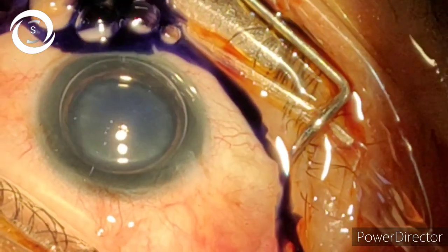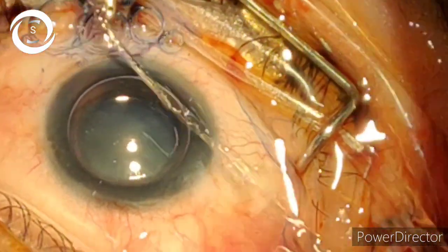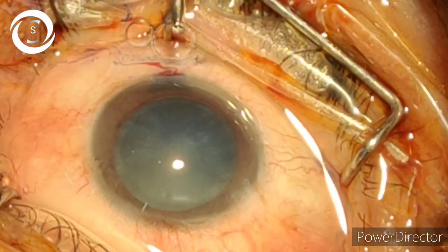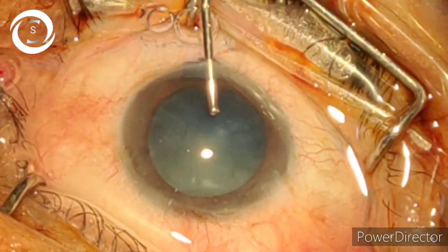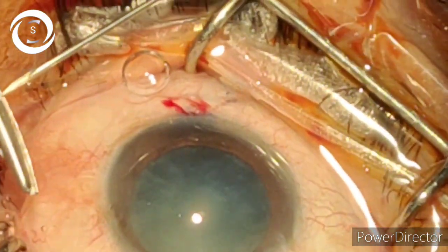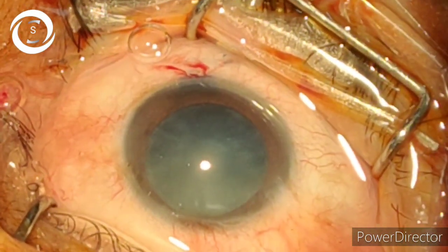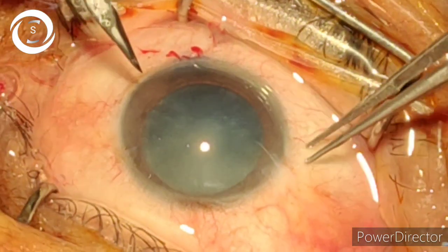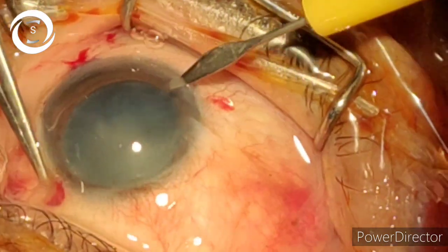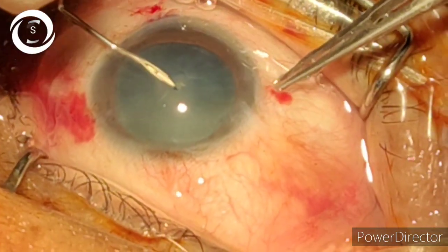Phacoemulsification is one of the most common ophthalmic surgical procedures. It has a long learning curve. Each and every step is extremely important, but two steps are universally agreed to be the most difficult to master: one is capsulorhexis and the other is phacoemulsification. In this video I will show you the full case from start to end, but our main focus is on my modified tilt, rotate and chop technique, which is one of the safest techniques to avoid posterior capsular rupture.